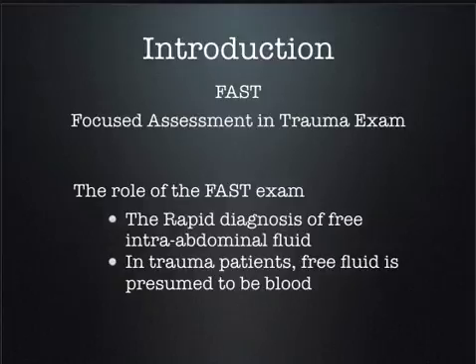So we're really going to talk about it in the context of trauma, but it could be that you're doing it in the context of many other things. This is that clinical integration. So it's not just for trauma, it's for a lot of things, but we're going to keep it really in the realm of trauma for the lecture. All right, when I was talking to medicine and family medicine last week, we really talked about a lot of other things, but in this case, for most of you guys, we'll talk about trauma.